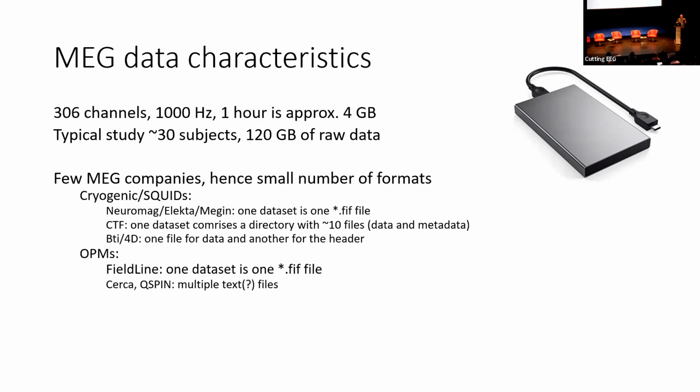There are only a few MEG companies. That also means that we have only a few types of data formats to deal with. We have NeuroMag with FIF files that we're working with here. At the moment, we have a CTF system. Here in Marseille, they have a BTi system. There are not so many BTi systems around anymore, as they are not being made anymore. But soon we will also have more OPM systems, and with OPMs the market is going to open up, so we're going to have more file formats again.